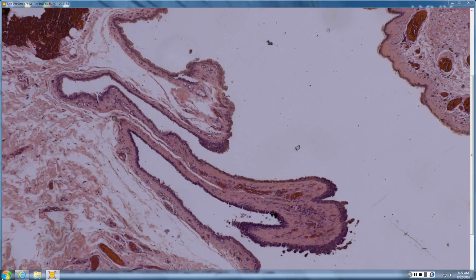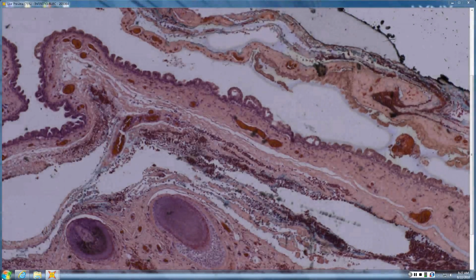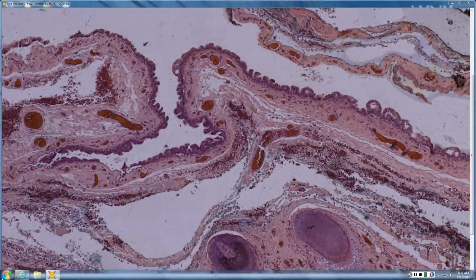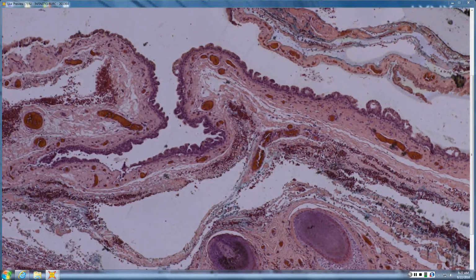How about this, Blake? Hydrocystoma. Hydrocystoma, and in some areas you can see that it's forming tubules and things in the wall. So what would you call something that's like a hydrocystoma that has adenomatous elements? Adenomatous hydrocystoma. Yeah, or a cyst adenoma, right? So cyst adenoma is like a hydrocystoma, but it's getting some tubules, so it's going towards an adenoma. So the ones on the nipple are very adenomatous. The ones from other sweat glands, they start with just little tubules and little papillomatous areas within the cyst, which is why it's called a cyst adenoma, because it's adenoma in a big cyst.